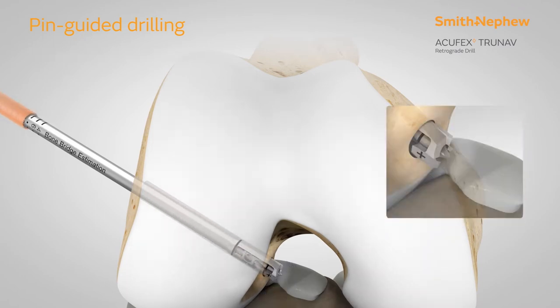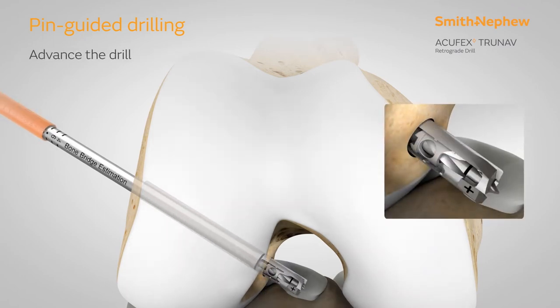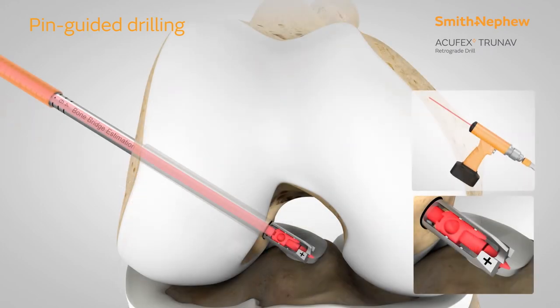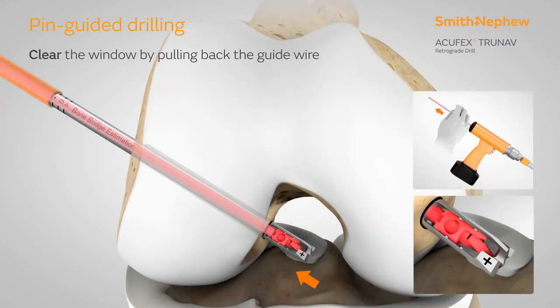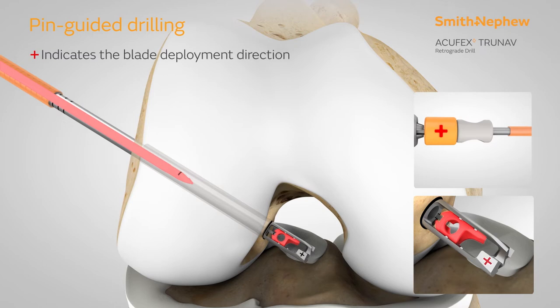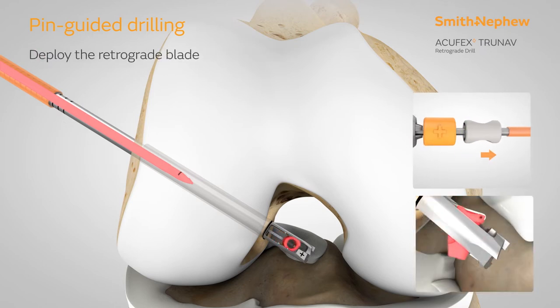Once in the notch, advance the drill tip until the laser line is visible. Clear the window of the drill by pulling back on the guide wire until tactile feedback is felt. Position the plus sign in the desired blade deployment direction. Deploy the retrograde blade by advancing the grey knob towards the knee.